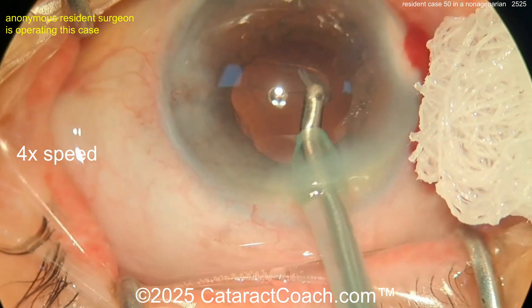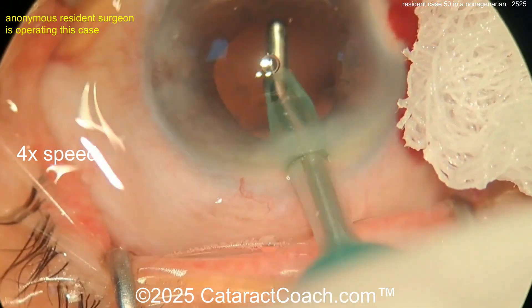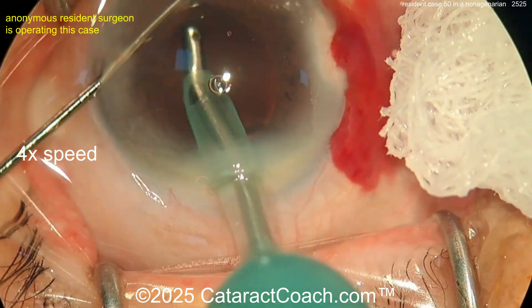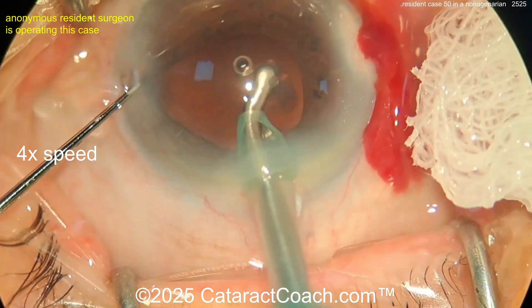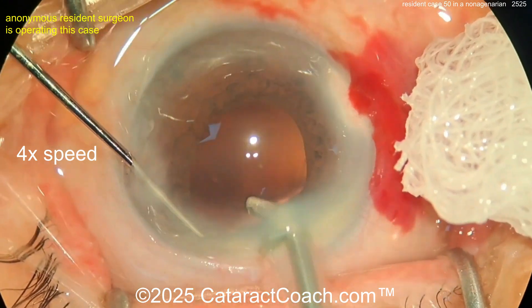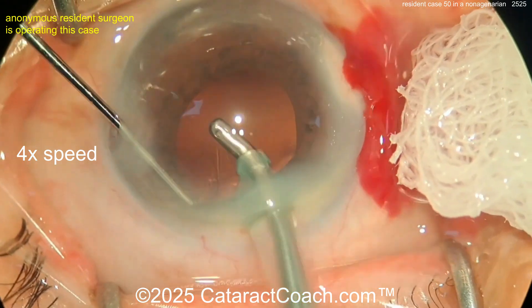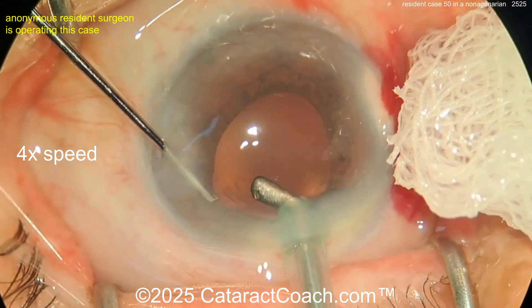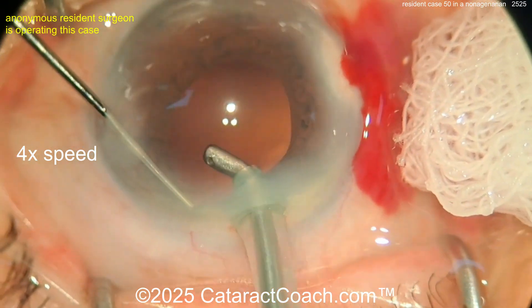Now for a 90-year-old, ask yourself what was the patient's pre-operative refraction. If they were close to emmetropia or slightly myopic, maybe leave the patient a little minus — if a 90-year-old isn't driving anymore, wouldn't you rather be minus one or minus 0.5 instead of absolute plano? But if they spent their whole life as a plus-three hyperope, you probably don't want them myopic — in that case I'd aim for plano. Here at the end, cleaning it up nicely.